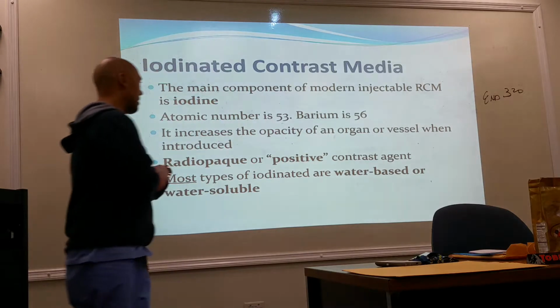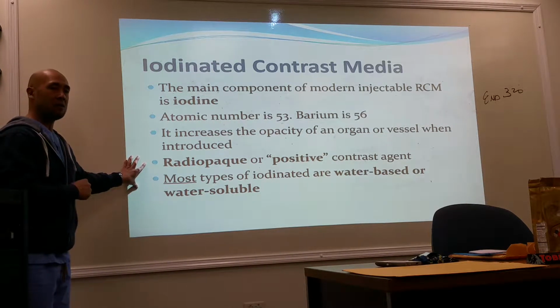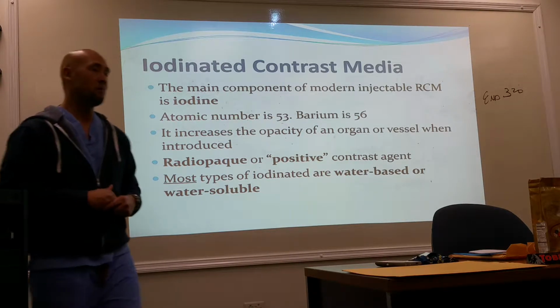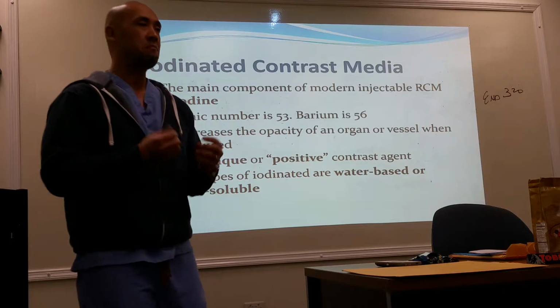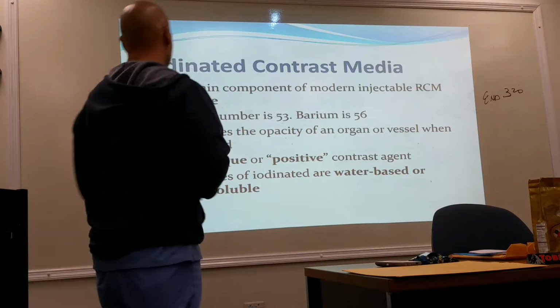We say it's radiopaque because it is a positive contrast media. Radiographically, how does it look? White. It's white, right? Because it has the ability to absorb X-rays, and it mimics the same characteristics of bone. So it appears white on a radiograph.